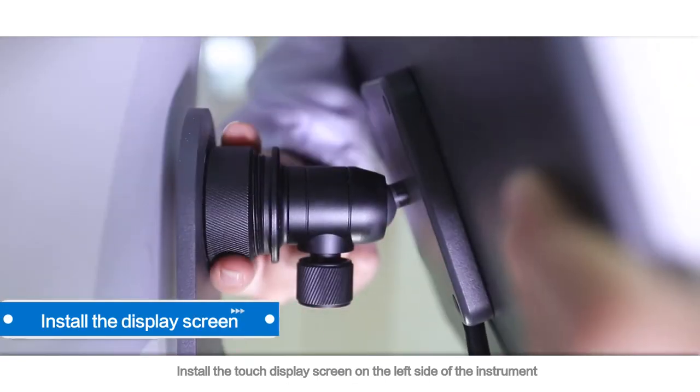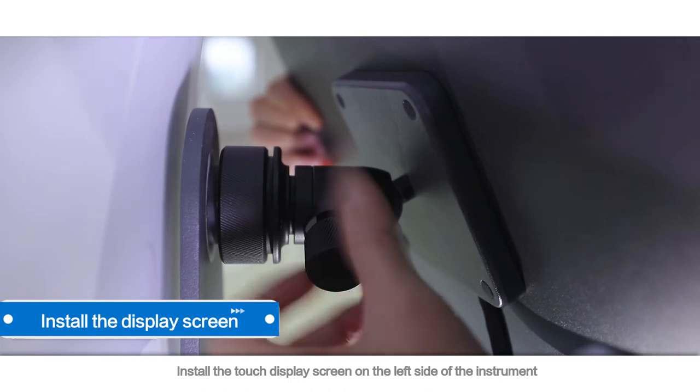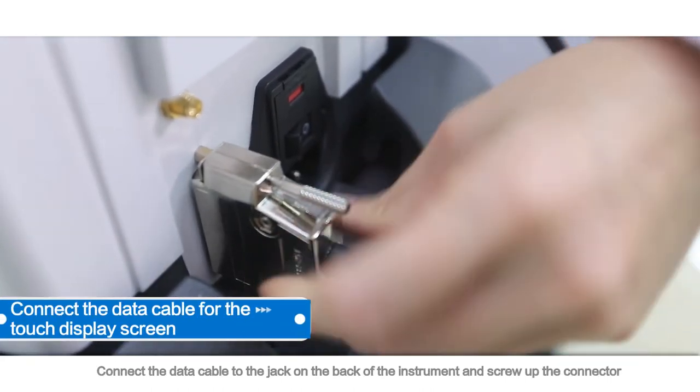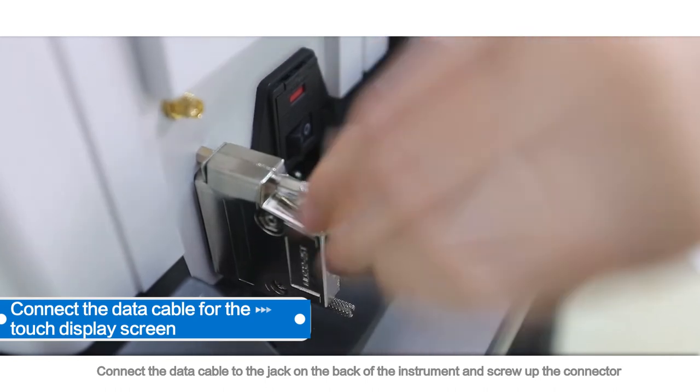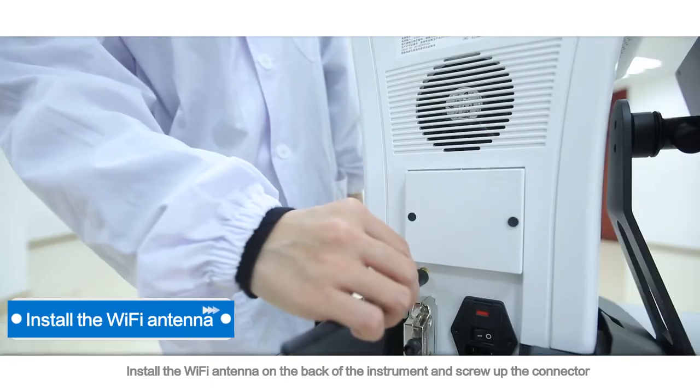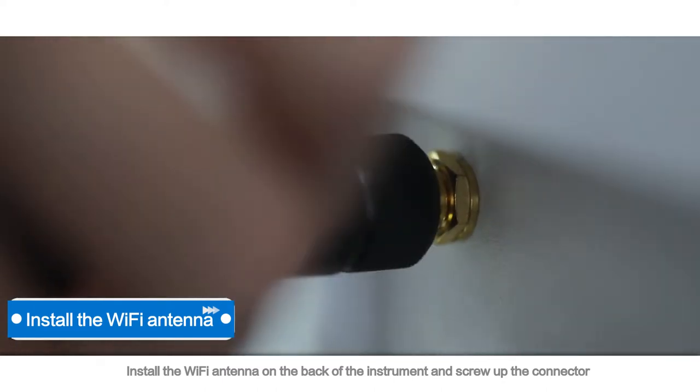Install the touch display screen on the left side of the instrument. Connect the data cable to the jack on the back of the instrument and screw up the connector. Install the Wi-Fi antenna on the back of the instrument and screw up the connector.